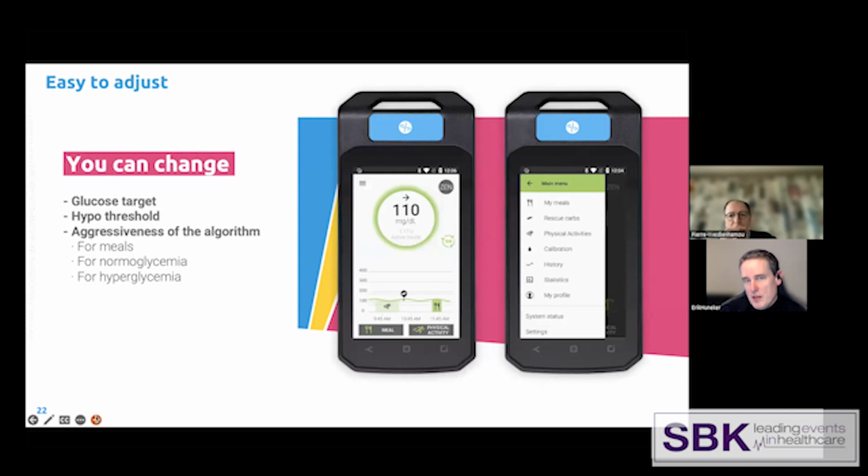The personalization: you can set the target, you can set the hypo threshold, because certain patients are either more comfortable, or as a medical professional, you want to set the targets lower or higher depending on this patient's personal profile. You can set the hypo threshold at 70, 80, 90 milligrams. And you can set the aggressiveness.